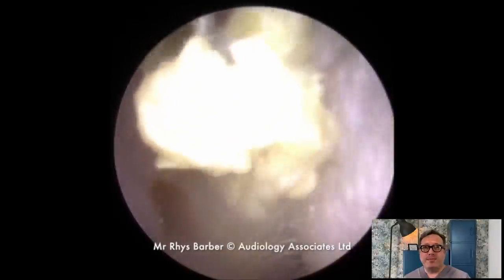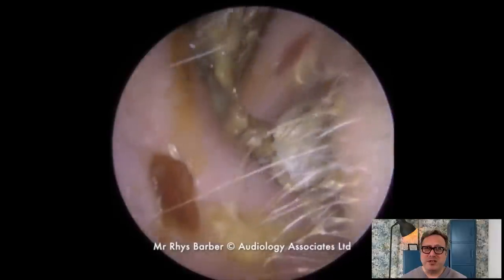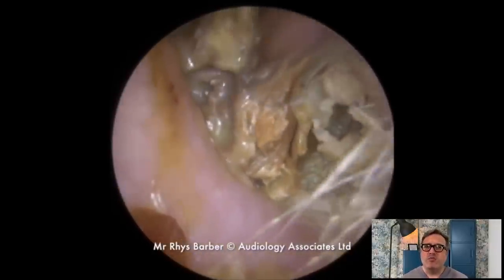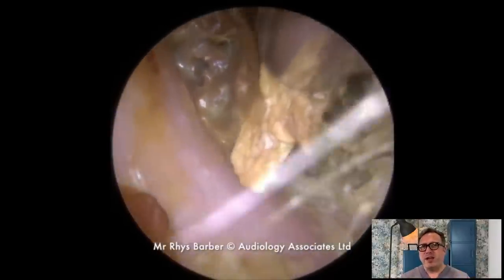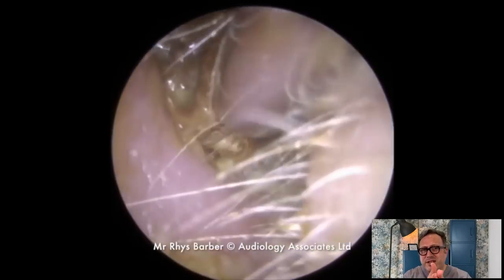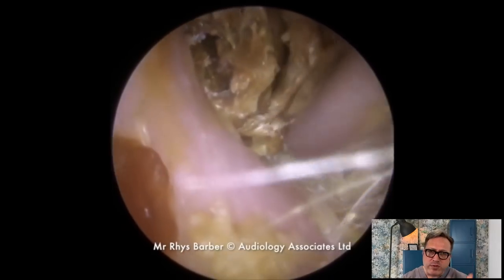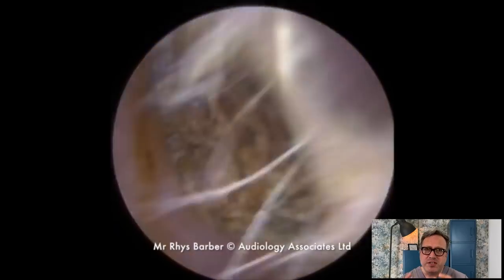Looking at this particular ear canal, we can see we've got lots of dead skin debris here at the entrance to the canal. This lovely gentleman came through having quite a lot of hearing issues. This was a really interesting video — you can see a build up of skin debris, and you can see the plates as we're pulling this out, the actual plates of skin detaching from one another. This is a keratosis obturans type problem where you get a skin detachment and it binds around itself.